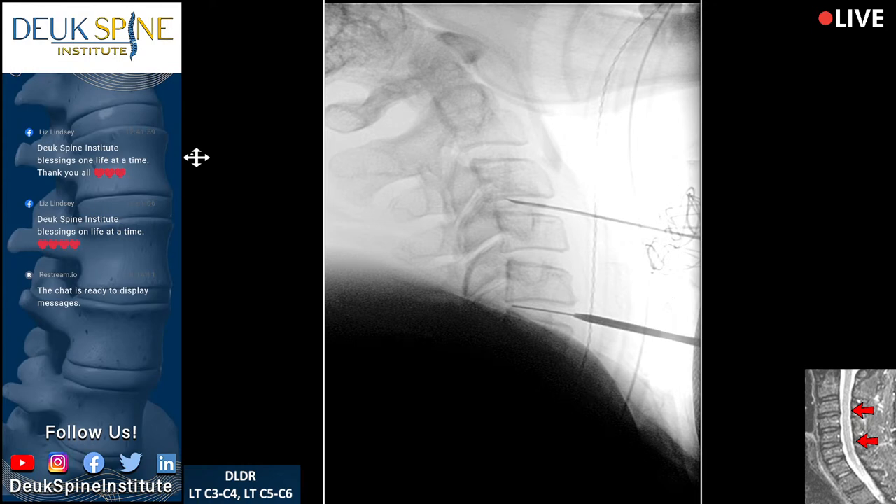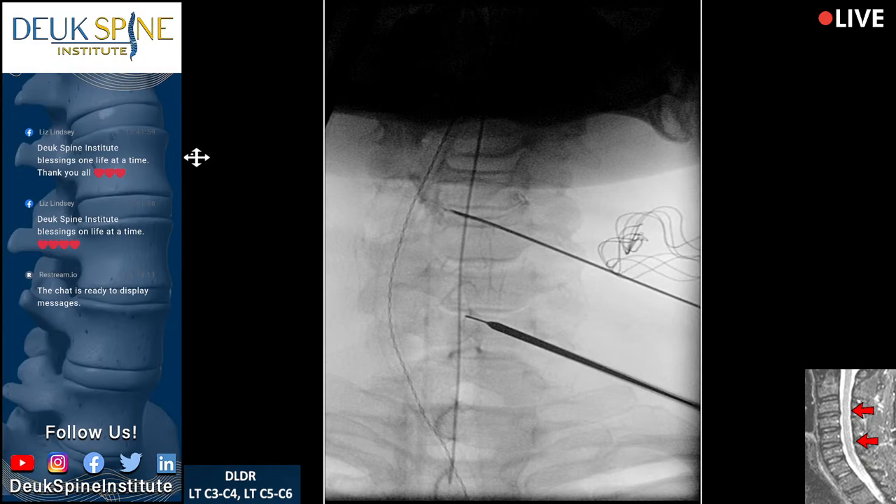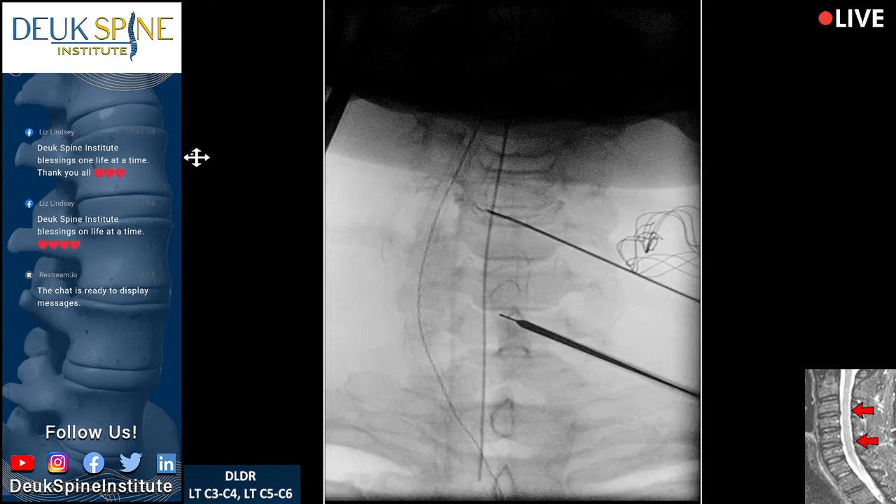For those wondering how long we've been doing this type of surgery: 16 years at Duke Spine Institute. Have we published this procedure? Yes, absolutely. Go ahead and line up the spinous processes a little better. Look at the tip of the dilator — it's right superimposed over the spinous process of C5.